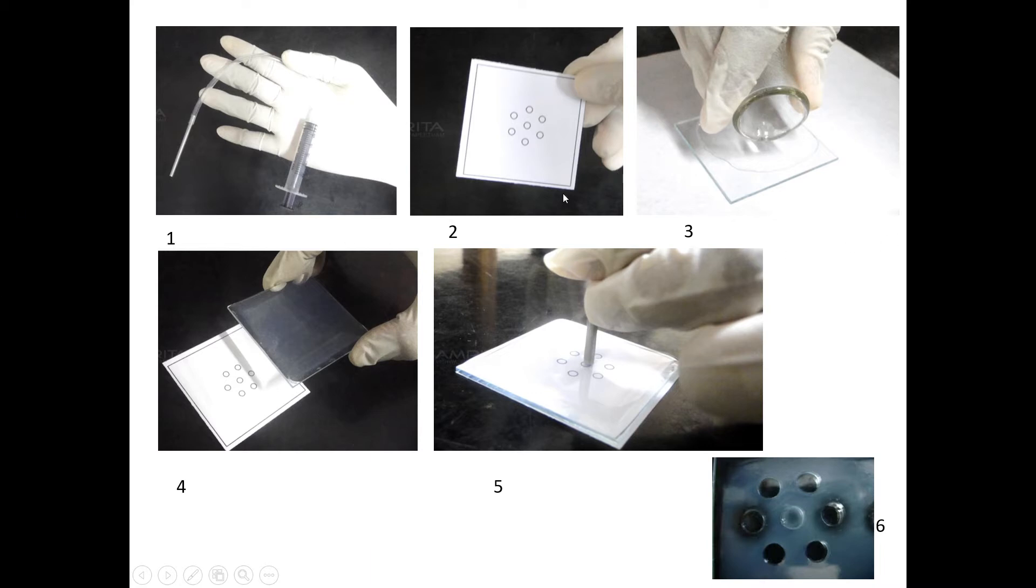First, weigh 1 percent or 1.2 percent of agarose and dissolve in the respective volume of 1X phosphate buffer saline. Then boil until the agarose goes into solution—that is, you need to get a clear solution.